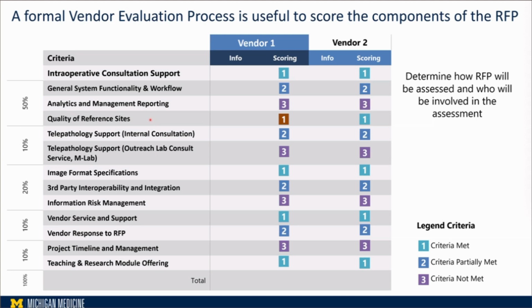This is extremely important. We went, literally, after we had presentations from them, we visited multiple sites that those vendors already provide clinical workflow for, or even we reached out to them remotely. Things that we also did, we visited some headquarters of those vendors as well. We asked, for example, from digital pathology, what format they can provide, whether they have third-party interoperability and integration. We also asked what their support is, how they respond to the RFP.